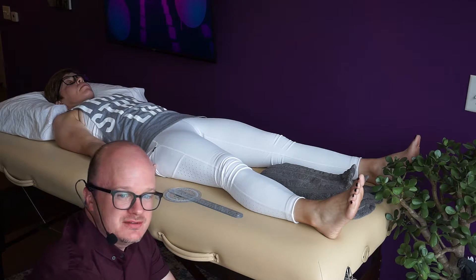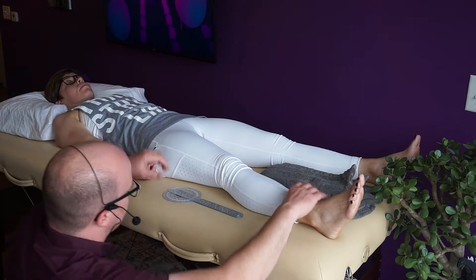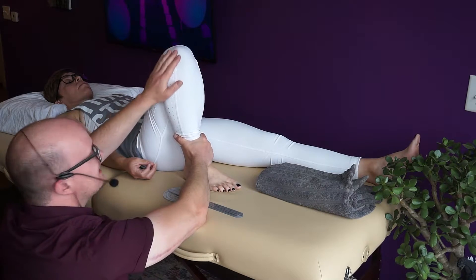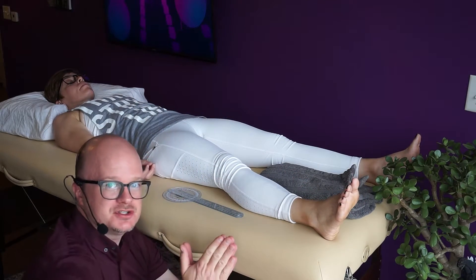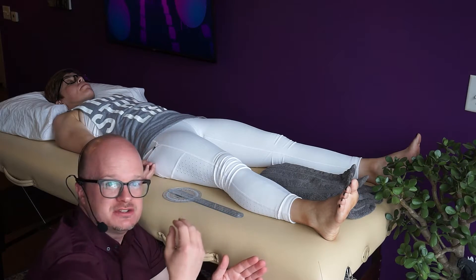The first end feel you'll see with knee flexion is soft tissue approximation — a soft end feel. When you flex the knee and push the passive range of motion, it stops because the gastrocnemius and the hamstring are compressing against each other. That's soft tissue approximation, your soft end feel. That's normal — that's what we should have.